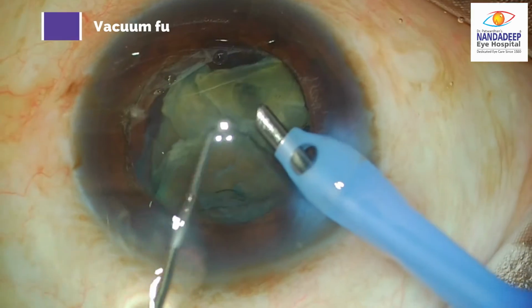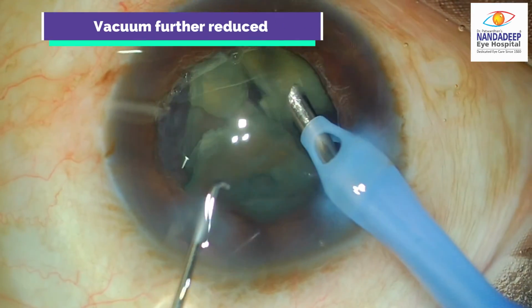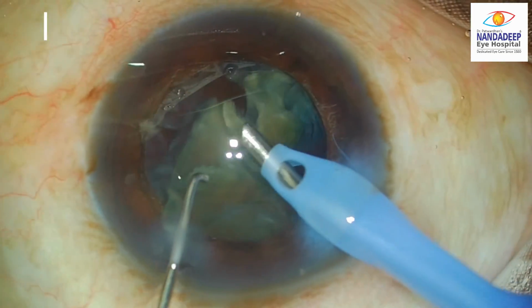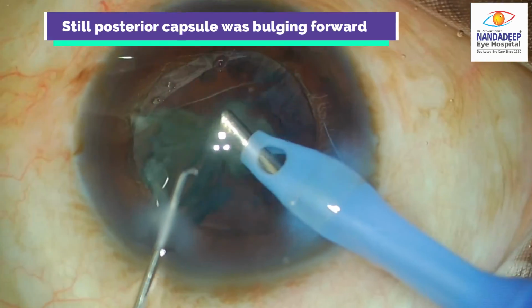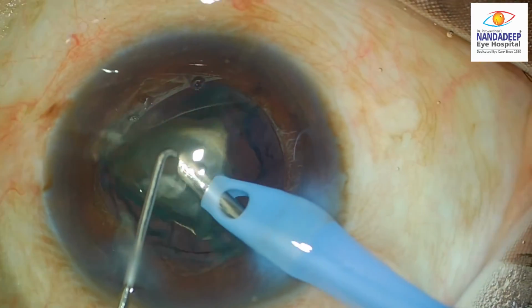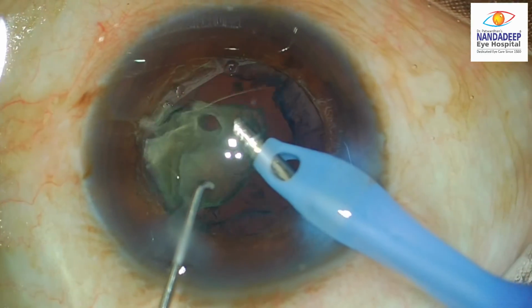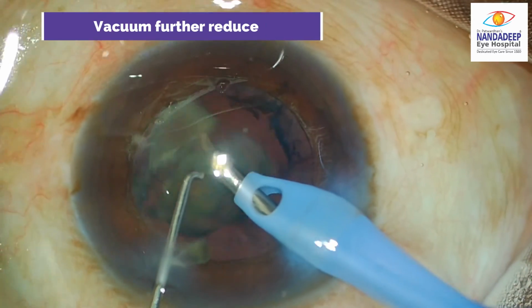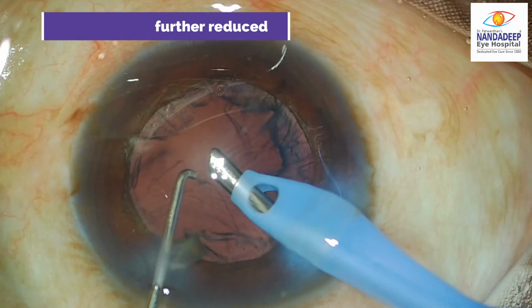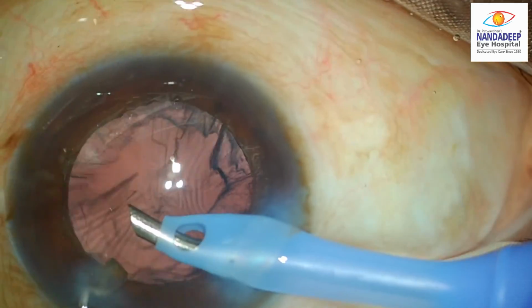The vacuum of the phacoemulsification was further reduced and the phacoemulsification resumed. But still, the posterior capsule was bulging forward.